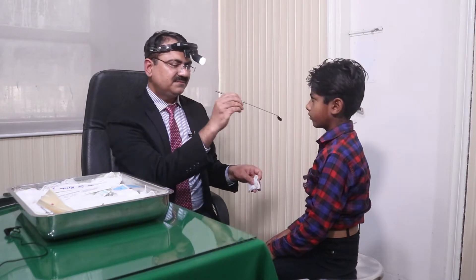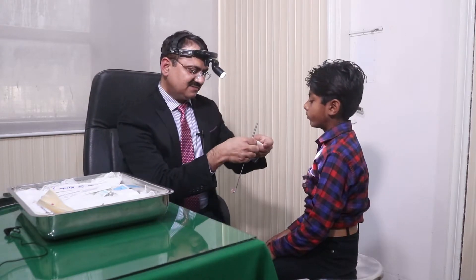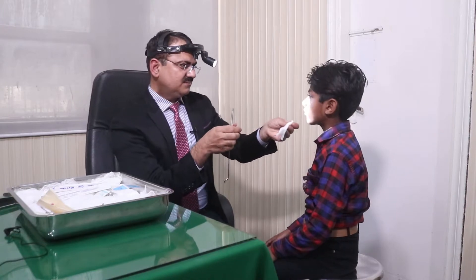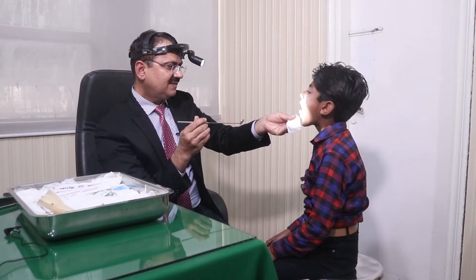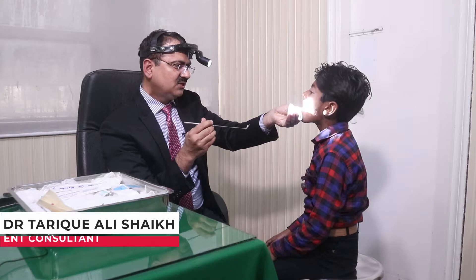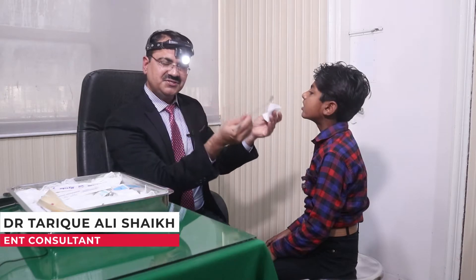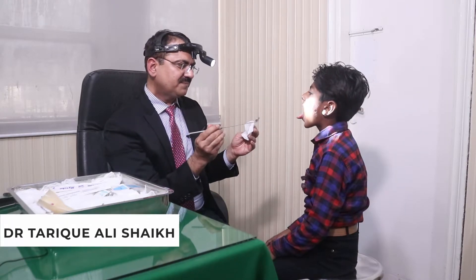You have to examine the laryngeal examination with the mouth open. You have to give instructions to the patient.